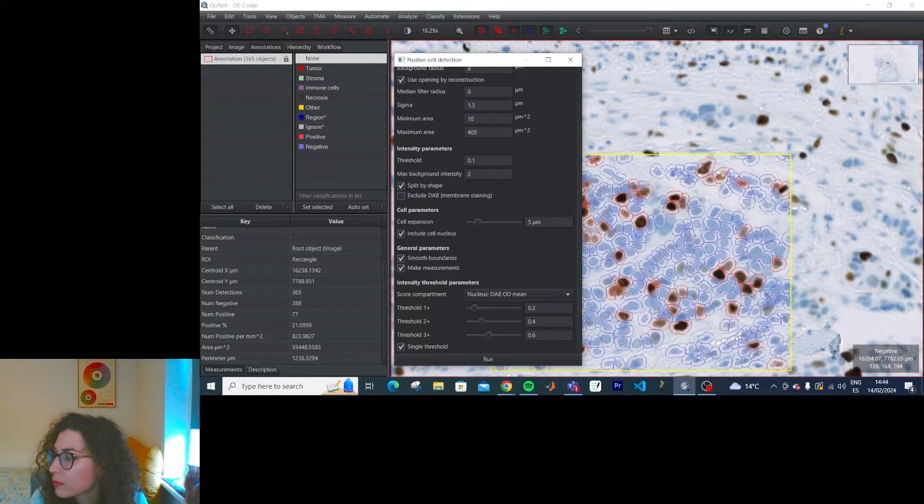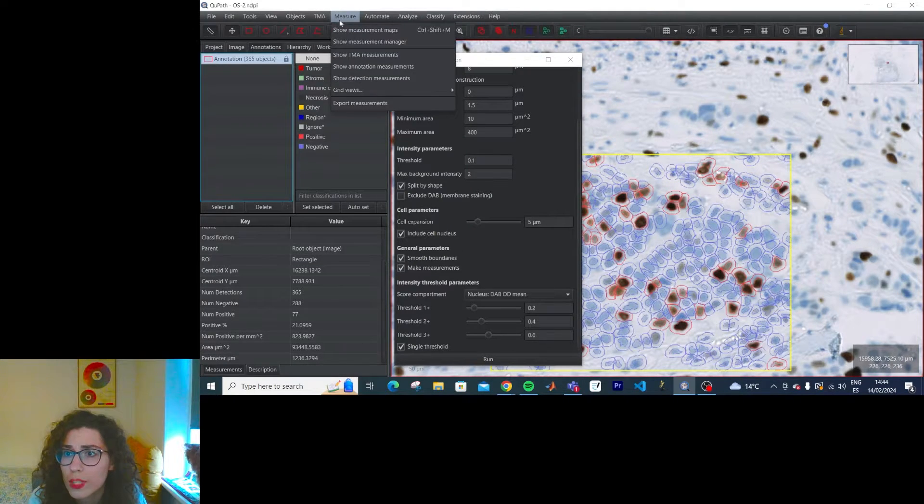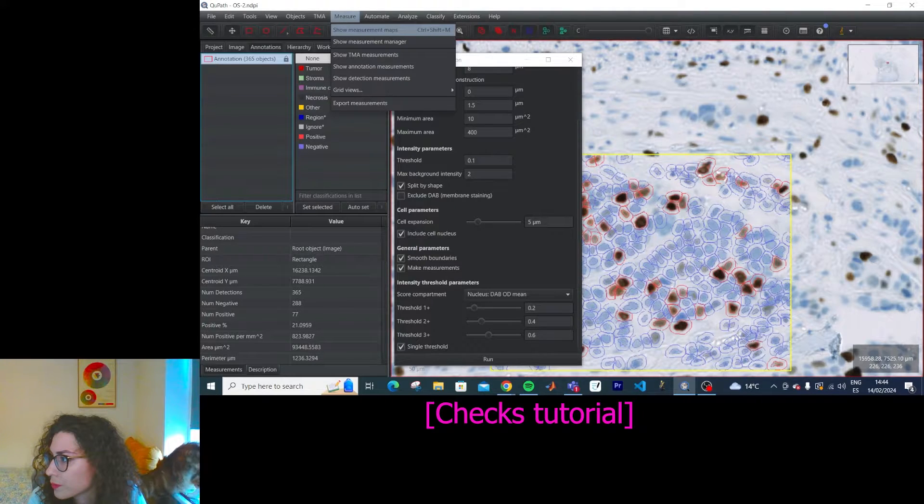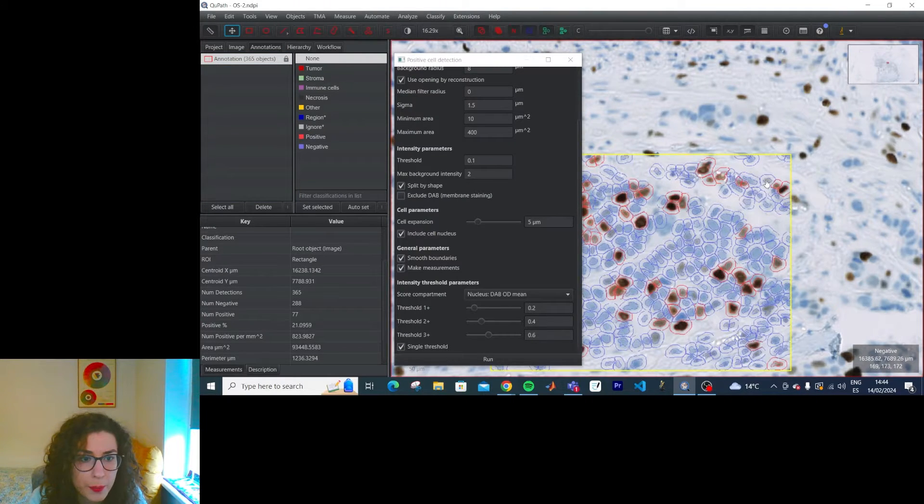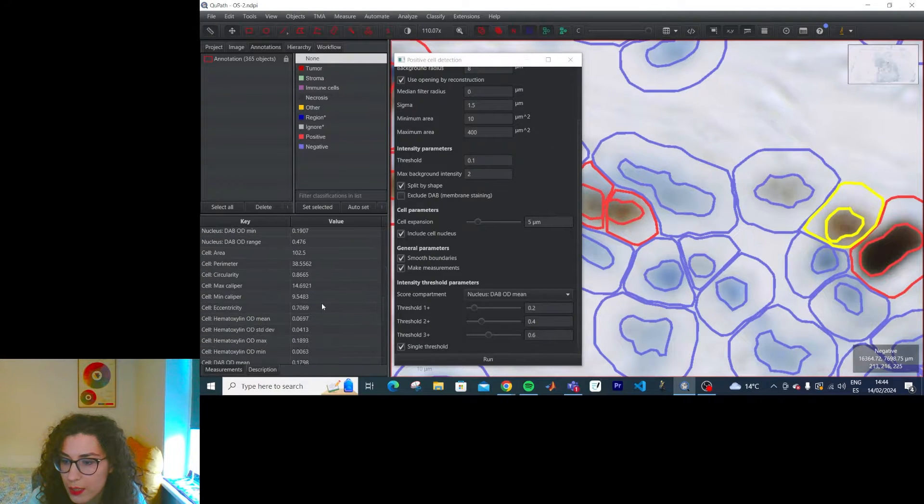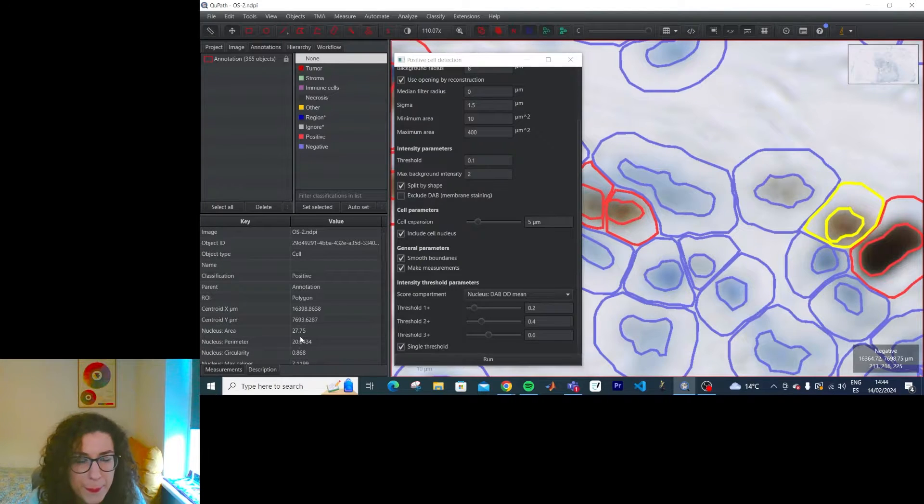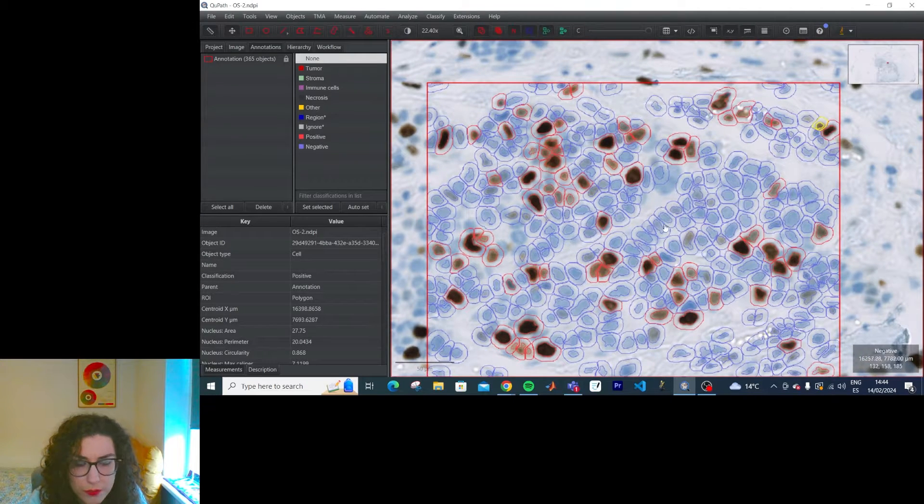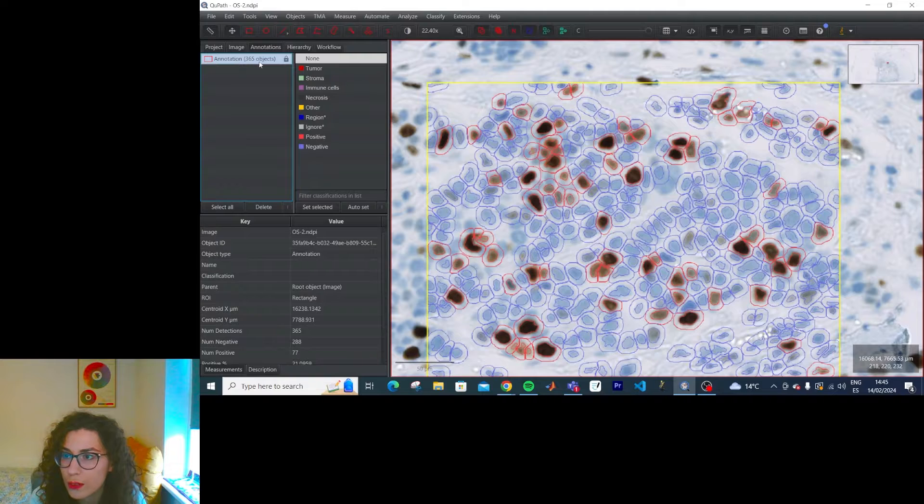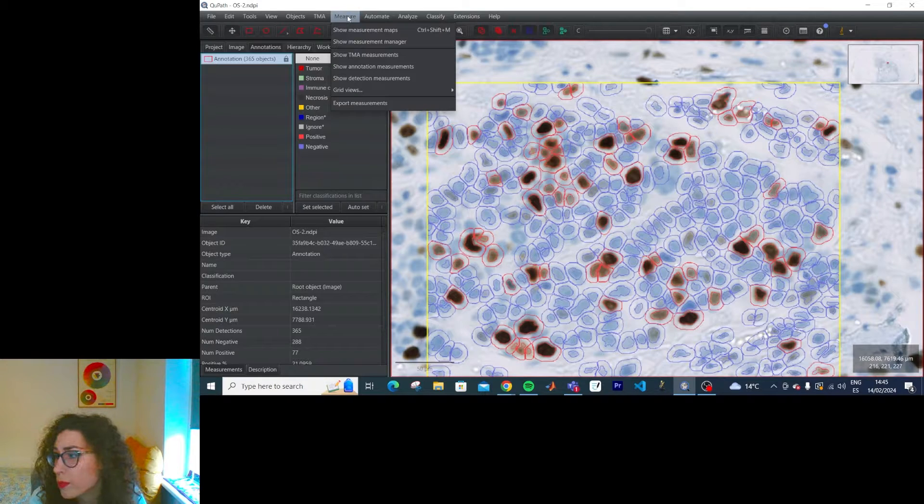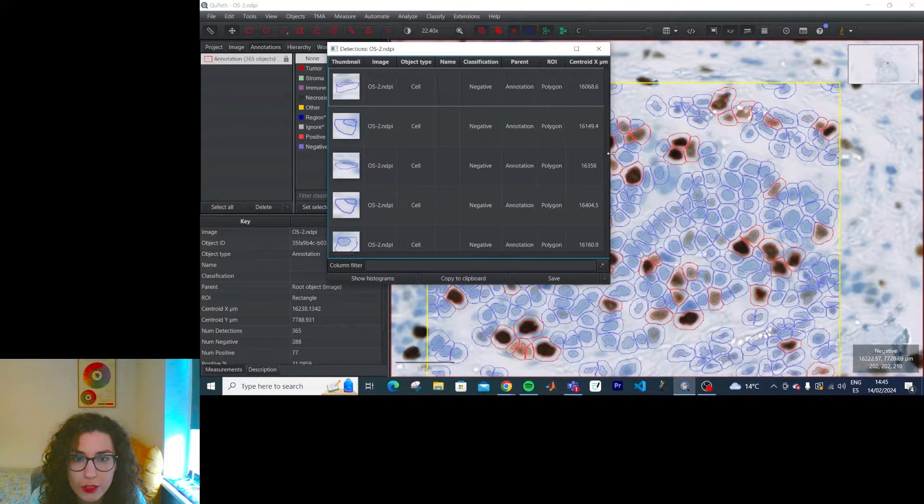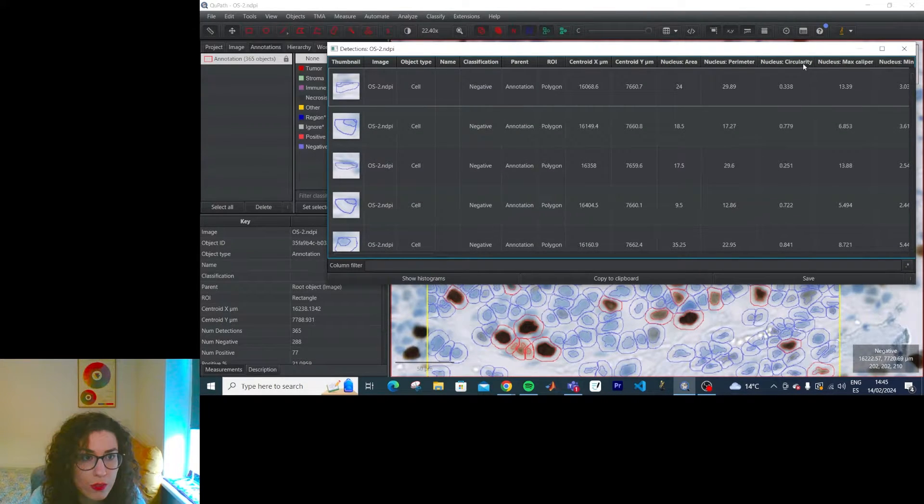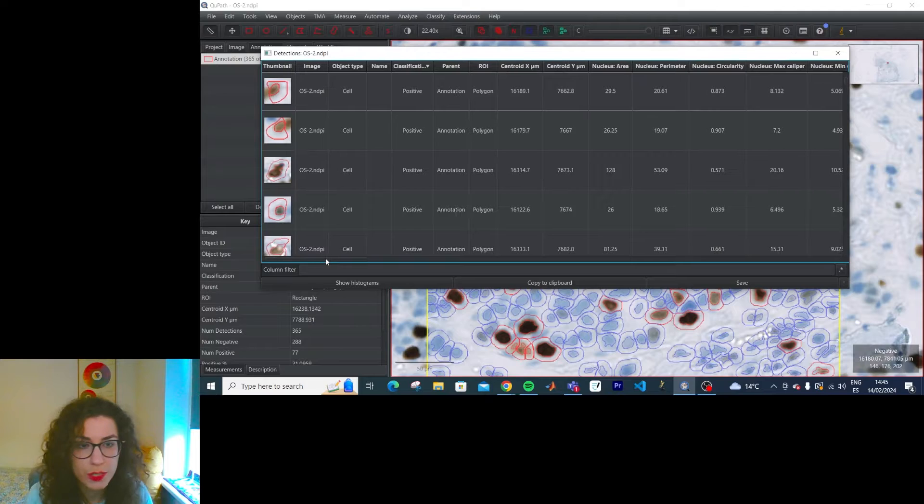But I don't like it like this. How do I get a table or something? Measure. And I get all the data of that individual cell. Useful, but not that useful for like visualization purposes. What else can I do? I can select my annotation object and do measure show detection measurements. Oh, now I get a picture for each of them. Cool. And can I order them? Yeah. Cool.